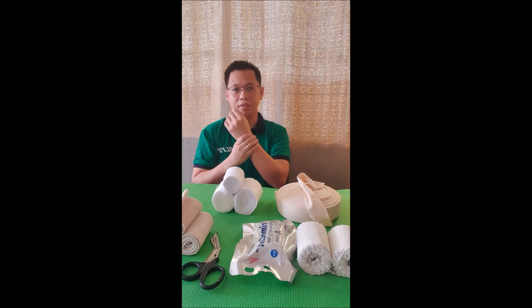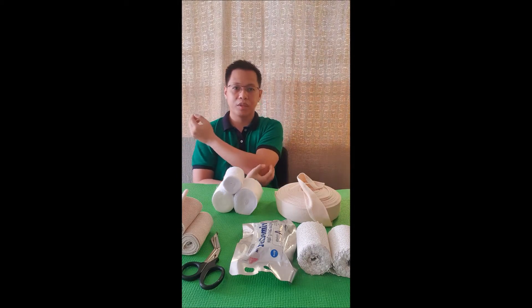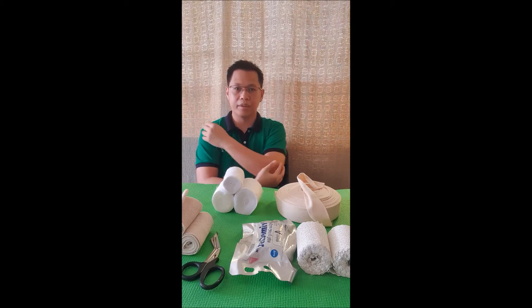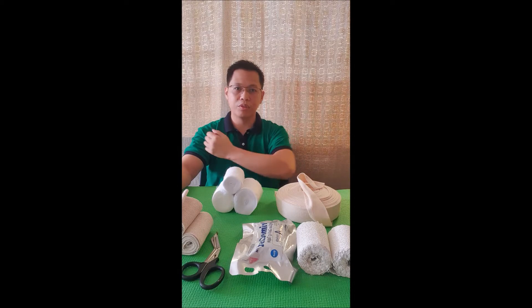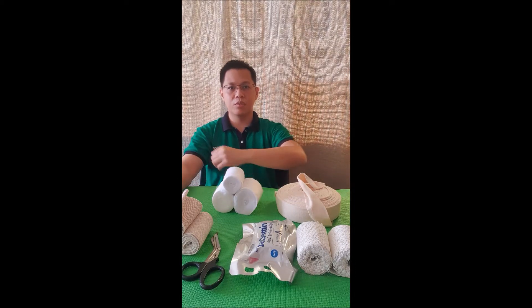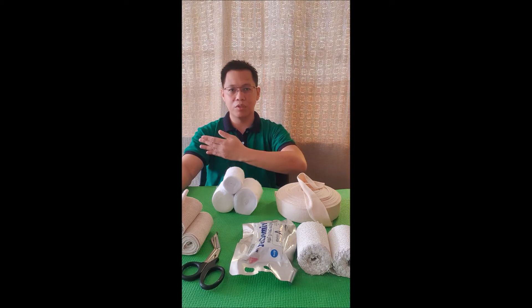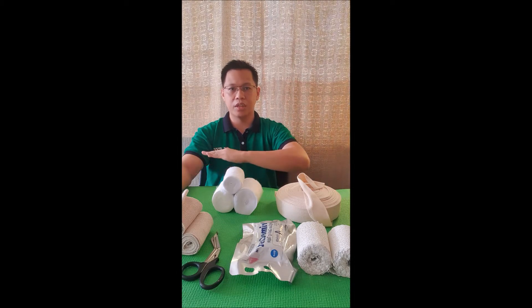This long arm posterior mold is used for injuries along the wrist area, the forearm area, the elbow, as well as the distal arm area. You can apply it with your elbow in flexion or in extension, with your wrist in extension or flexion, and with your wrist in neutral rotation, supination, or pronation.